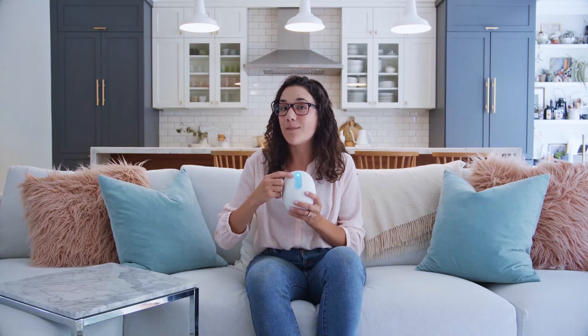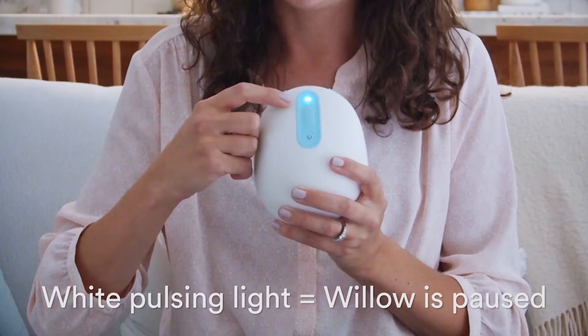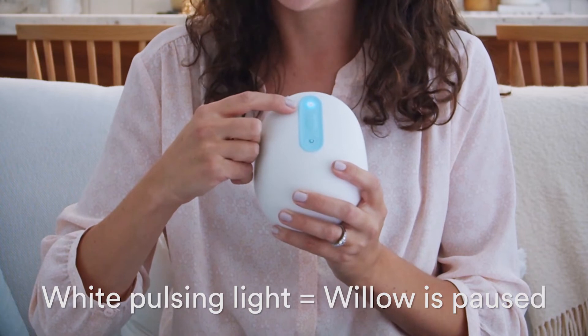The pump pauses automatically after 25 minutes of pumping. When that happens, the pump pause light will pulse.